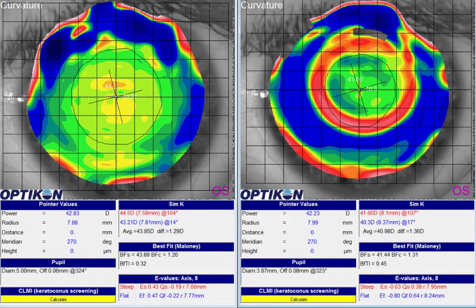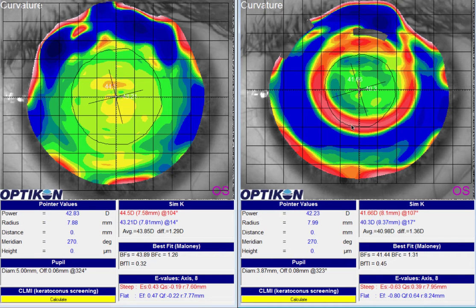In this weathered keratoconus case, we have a patient who's slightly under-corrected after treatment, and even with the residual refraction in place, it's not seeing very well. The post-treatment topography does show a little bit of superior decentration of the treatment zone. It's not so much that I'd expect the VA to be so reduced, but I think dropping this zone down should help the patient see a little bit better.